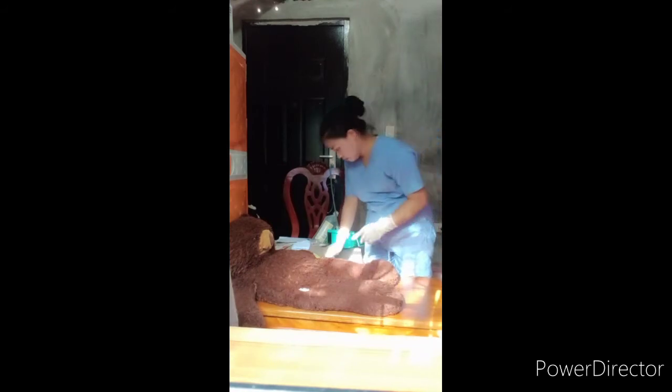So, for the first step, let's perform hand hygiene, done, and let's apply PPE if necessary, so done. Next, let's adjust the bed to the appropriate height, lower the side rails on the nearest side, and check the lock on the bed wheels to prevent moving. So, adjust the bed.